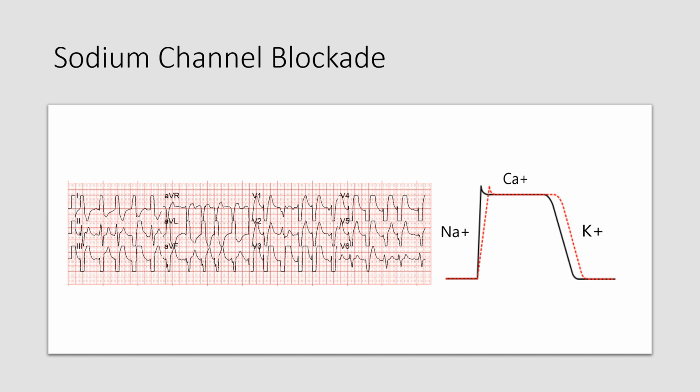So, of course, it's physical exam, common sense. Is your patient a 60-year-old with chest pain and heart disease? It's probably VTach. Is it a 19-year-old suicide attempt by overdose? Well, it's probably more likely to be a toxicity. So use your pretest probability to help differentiate. If you are truly unsure, if it's really a patient that could go either way, and you want to commit to using an antiarrhythmic, surprisingly lidocaine is probably your safest bet, because it's the least likely out of your ventricular antiarrhythmics to prolong your QT interval, and so it has much less of a torsadogenic effect compared to some of the other agents that we use.